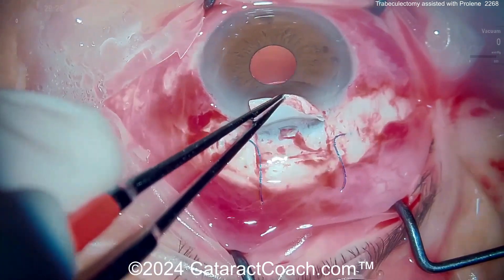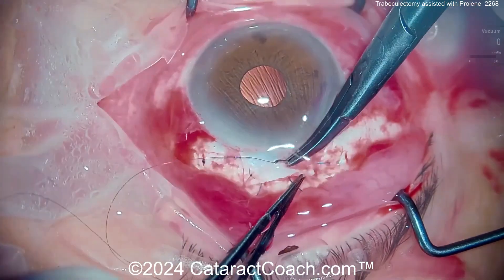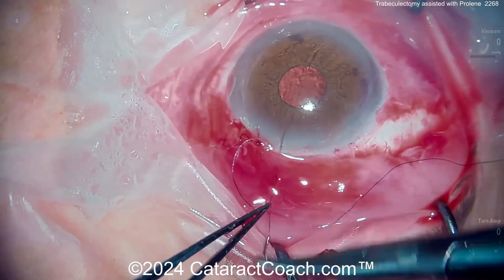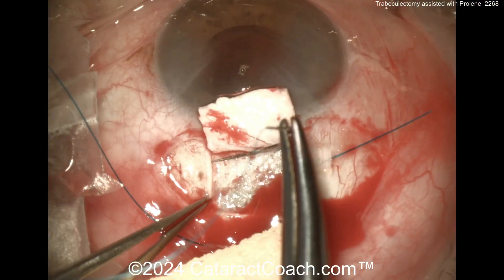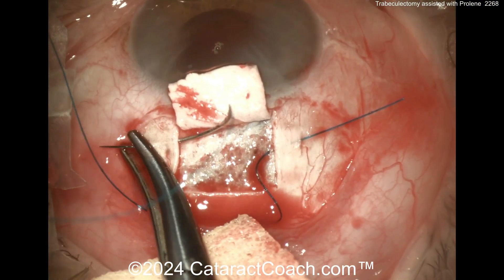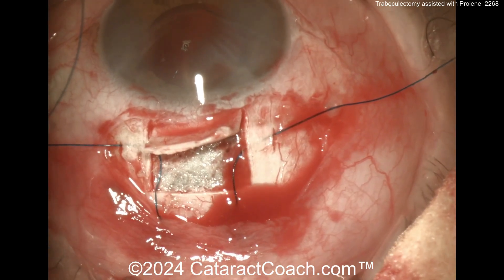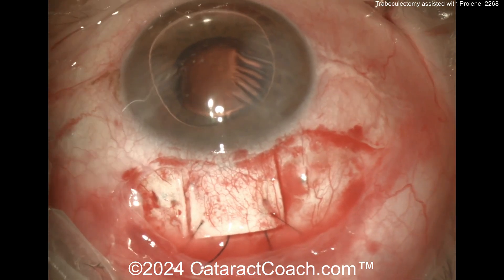This omega shape basically is going to prevent any scarring — it'll prevent that flap from sealing all the way down and closing up. Here at the end, the closure of the conjunctiva looks pretty good. The authors have good experience with this across many patients, and this has been previously published in the literature in their home country.